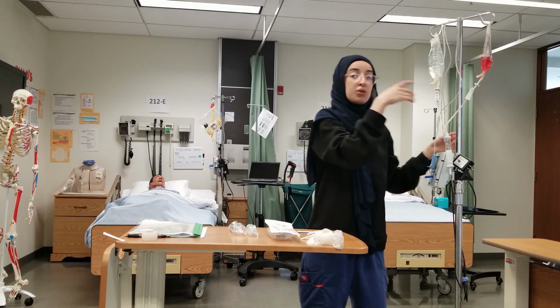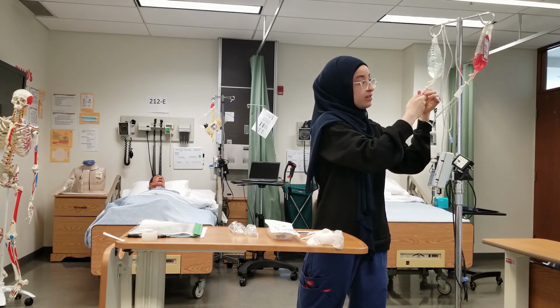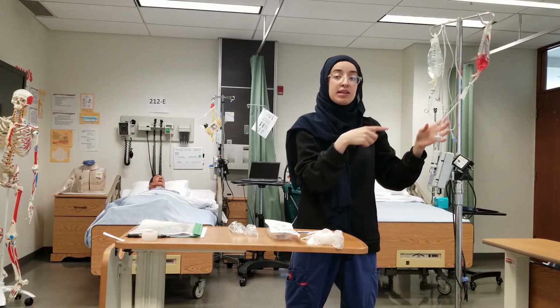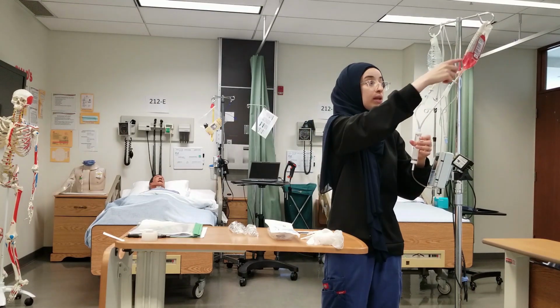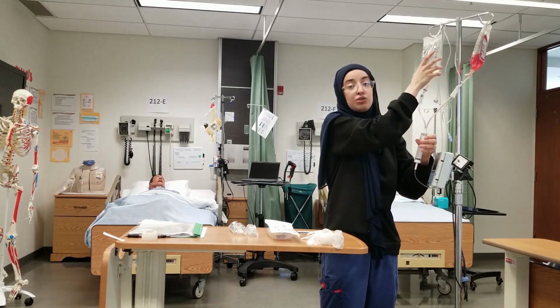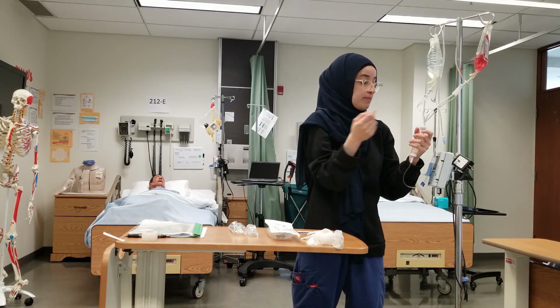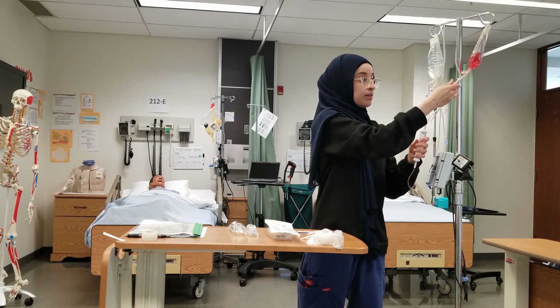Perfect. So once I have that spiked, I'm going to close the clamp moving upwards on my normal saline. You never want both of the clamps open at the same time, because the pressure in this Y section will equalize, and that blood, instead of going down, will actually want to go up into the normal saline bag. Then you'll just have a pink bag and you lose the blood that you're supposed to give to the patient. So make sure that clamp is closed before we open up our blood tubing.